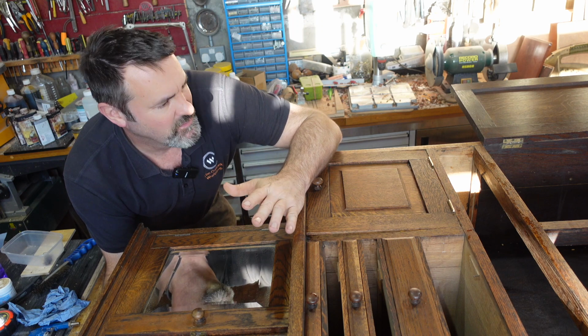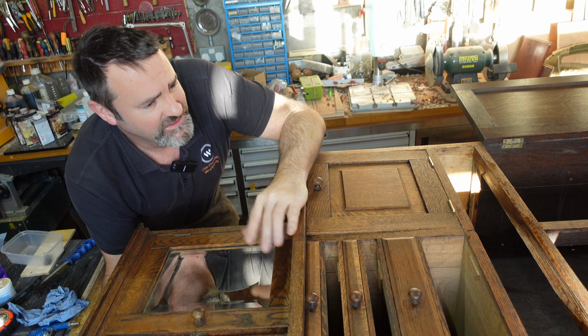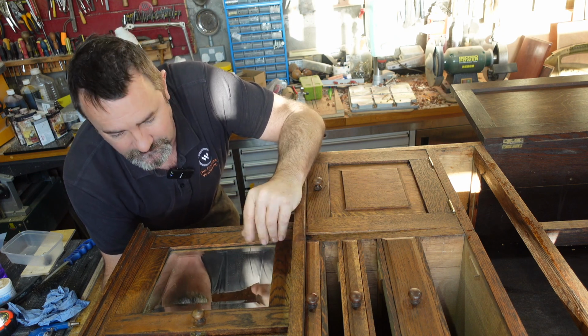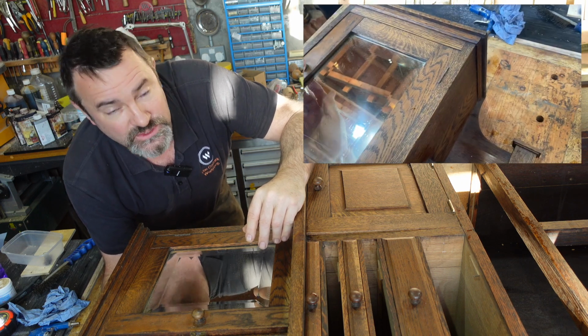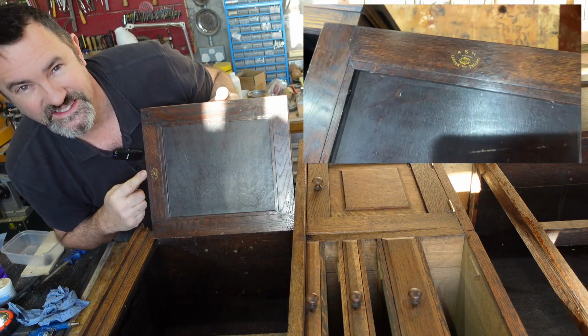So we're at what I like to call the getting to know the patient stage. I've stabilised it, cleaned it, and just having a look around for what needs done. But we're also on the lookout for maker's marks or labels, and inside this door here, there's this.